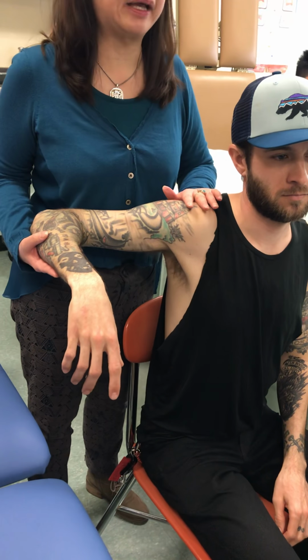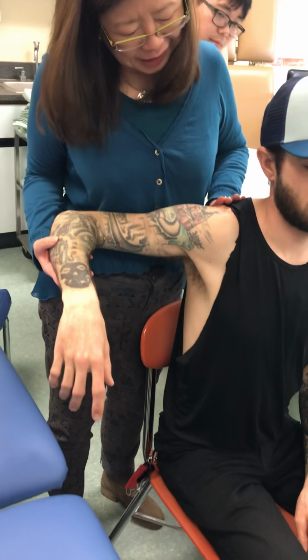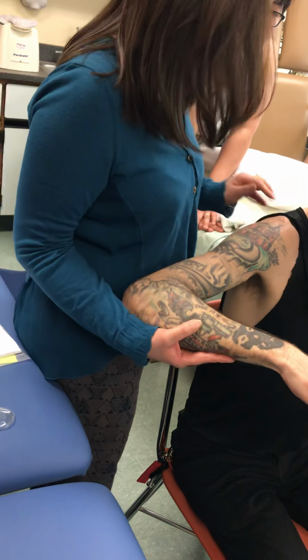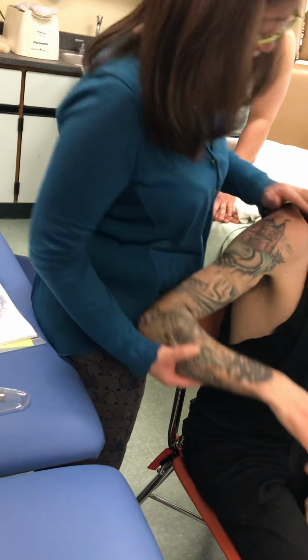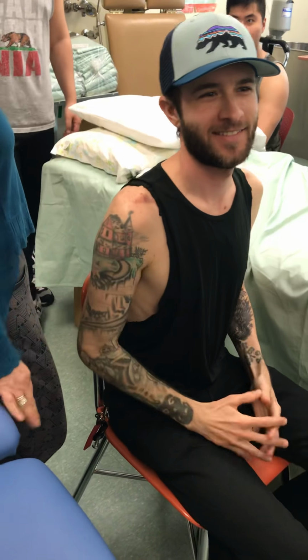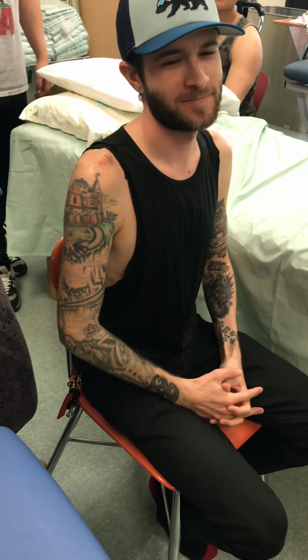For horizontal abduction, it will be firm, and he doesn't seem to like this too much. A little annoying, because he has had surgery on it. No surgery? You tell us this now. It doesn't hurt, but it doesn't feel right. It was like 2 years ago. Again, that proves the thing: you always need to be observant and ask patients questions. All right, are we good?